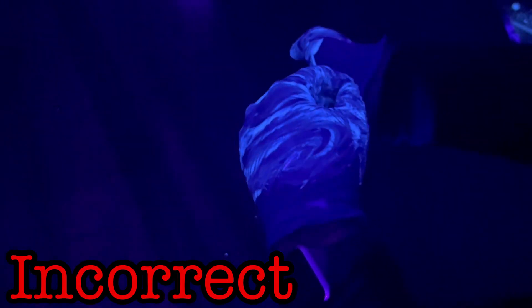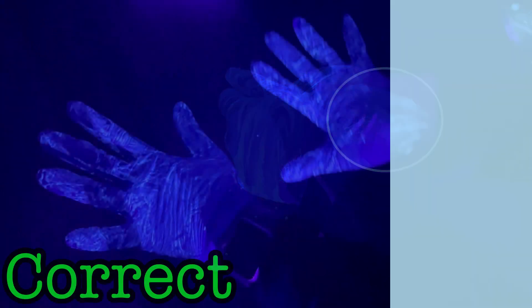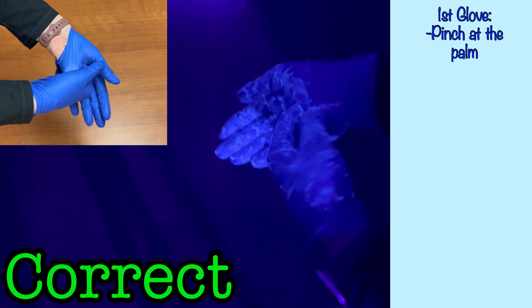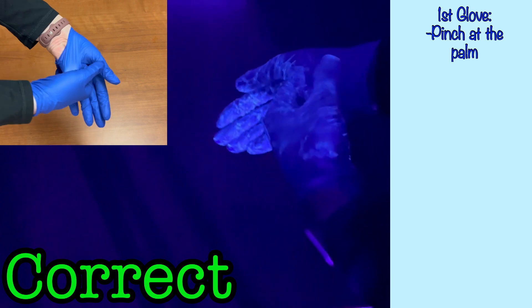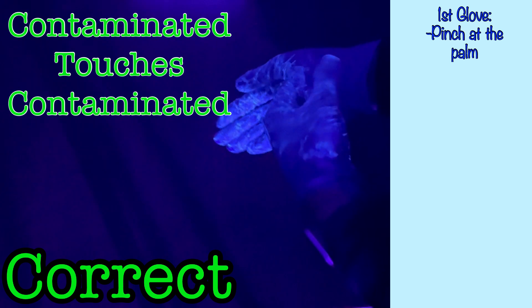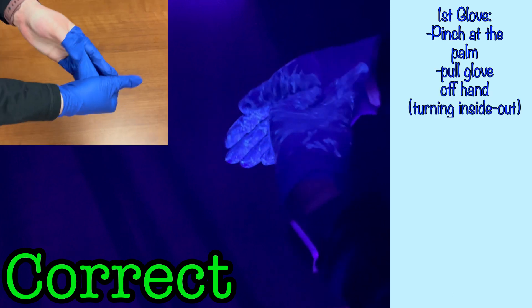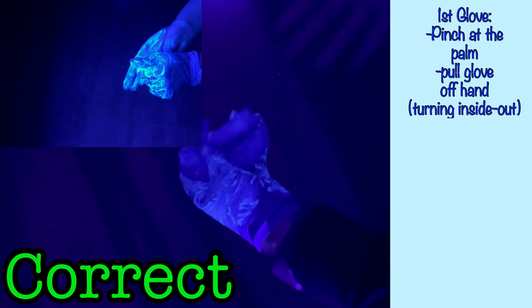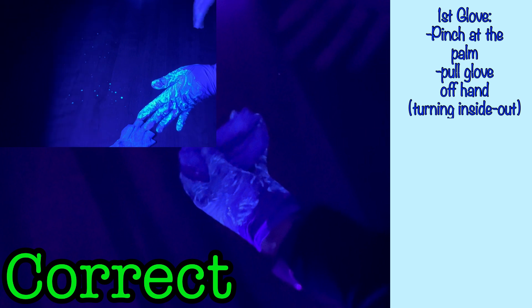In the incorrect technique seen here, to remove the first glove, the wearer grasps the glove from the cuff over the wrist, and in doing so, contaminates the skin on her wrist. The correct method for removing the first glove is to grasp by pinching the glove at the palm, so your gloved hand will not come into contact with any skin or clothing. The contaminated surface of one hand will only contact the already contaminated surface of the other hand. Then gently pull the glove off the hand, turning the glove inside out in the process. This will minimize the flinging of contaminant we saw with the incorrect method.